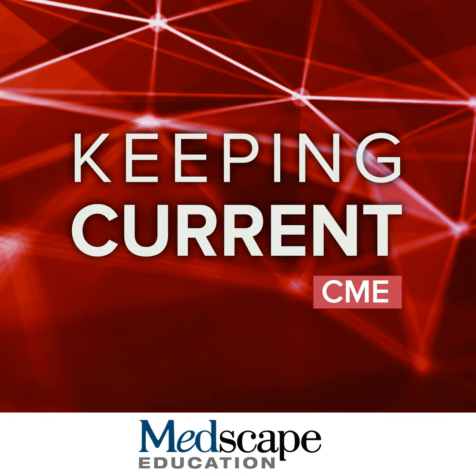different because with gadoxetate, because it is a hepatobiliary agent, the background parenchyma begins to uptake contrast more and more, and the contrast between the background parenchyma and the intrahepatic vasculature begins to change, making the appearance very different from what we're used to with extracellular contrast agents. And about 15 to 20 minutes following contrast injection, you can see that the appearance is quite different.